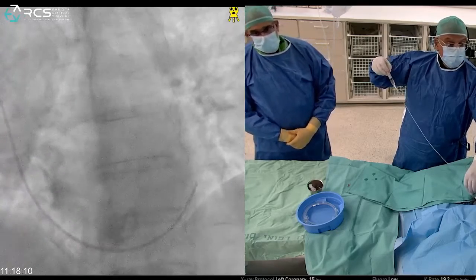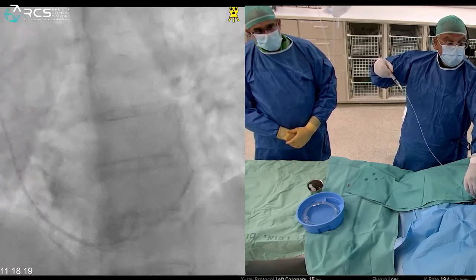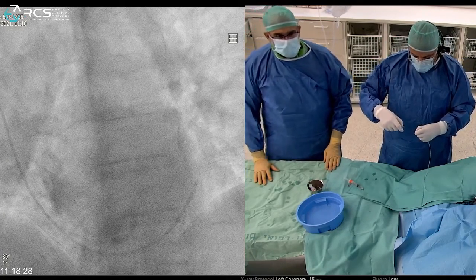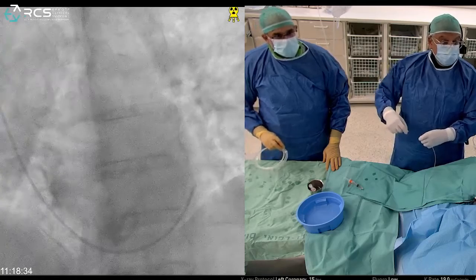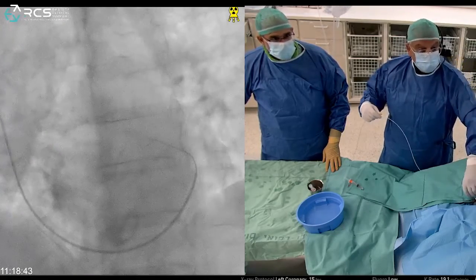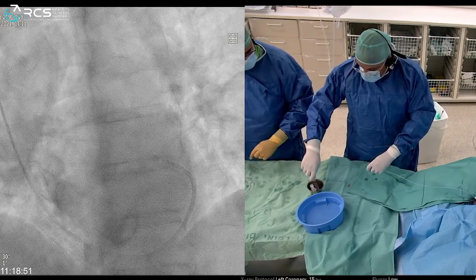I try to go to the great cardiac vein, which is at about 12 o'clock, but cannot do it. So I take a J-wire — a long J-wire — and advance it through the diagnostic multi-purpose catheter to the great cardiac vein at 12 o'clock, then advance the catheter to that level. Now I take the wire out and will do the first angiography of the coronary sinus.